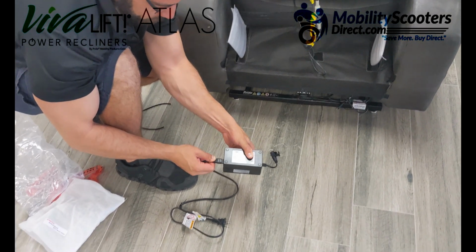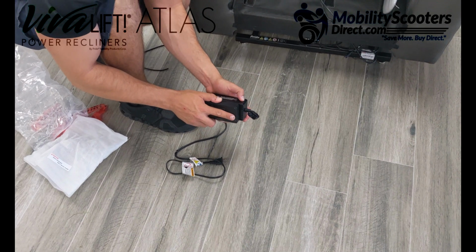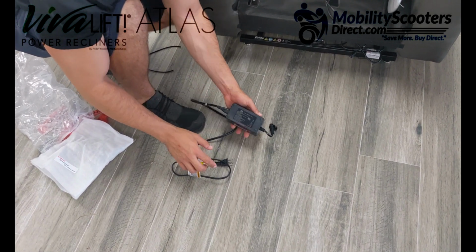The battery backup is attached to a little transformer. You can get a replacement battery. Do not use the battery backup as a main power supply.